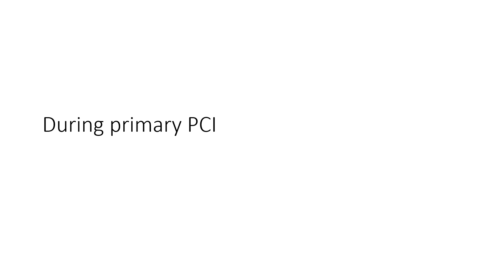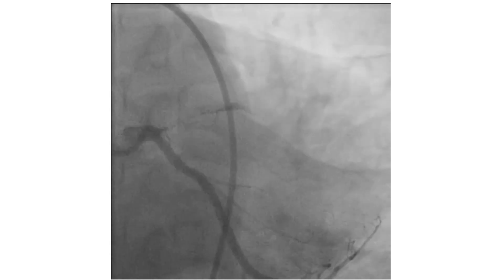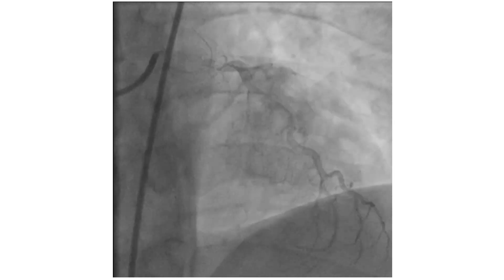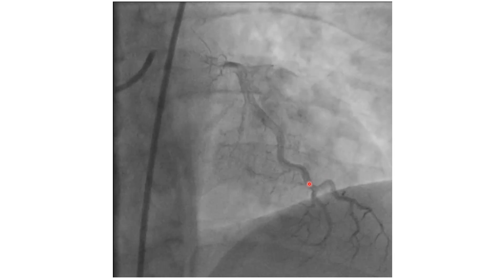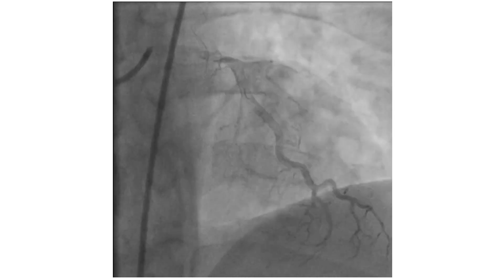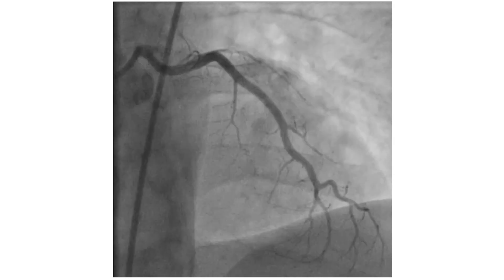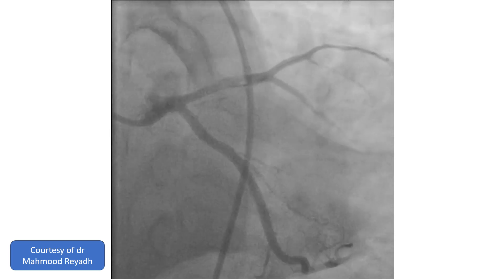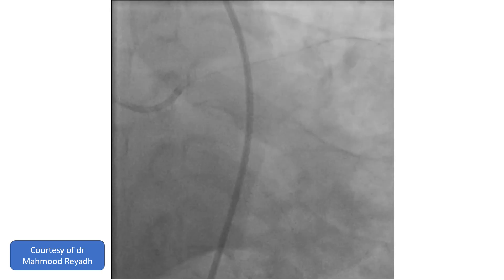This becomes particularly important when doing primary PCI because there will be no flow, whether antegrade or retrograde. In this case of anterior MI with total occlusion of the LAD, a large thrombus burden is found. There is no antegrade nor retrograde flow. We can see the circumflex, and the course of the LAD should be here, but there is no vessel in this view. The operator passed a wire and did balloon dilation, and now the course of the vessel is shown.